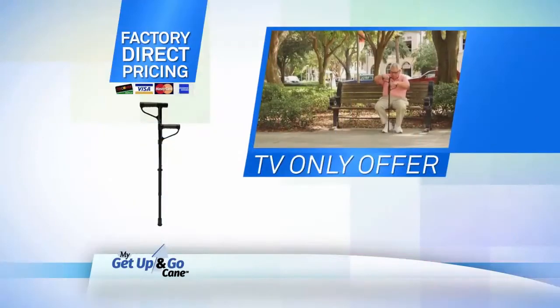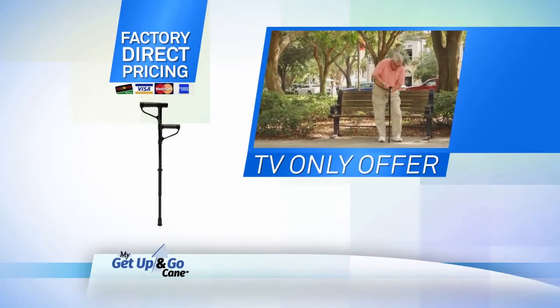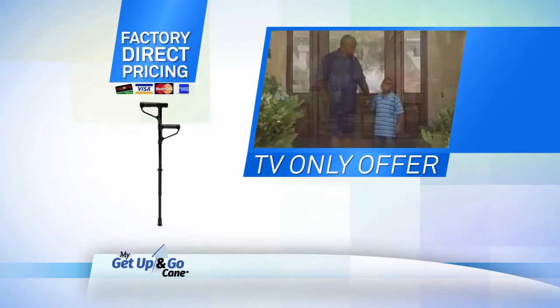As part of this special TV offer, we're releasing the brand new My Get Up and Go Cane at an unprecedented factory direct price, plus free shipping.